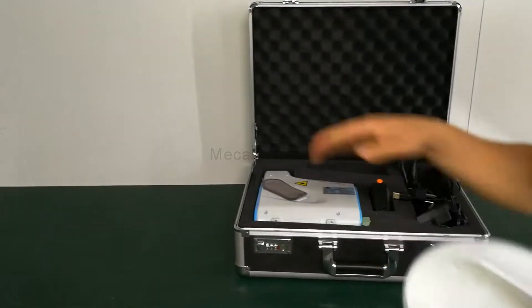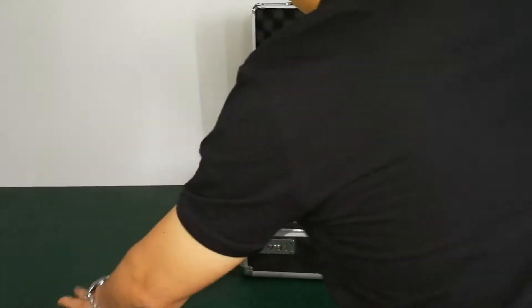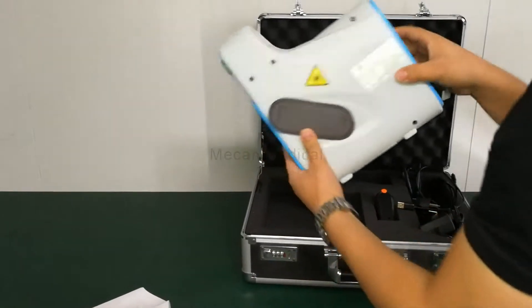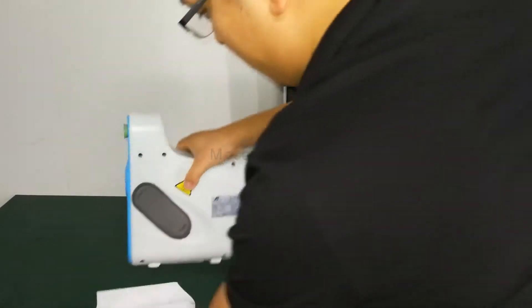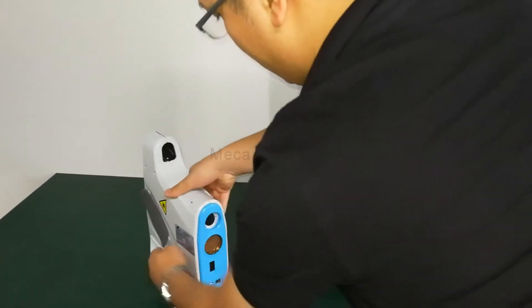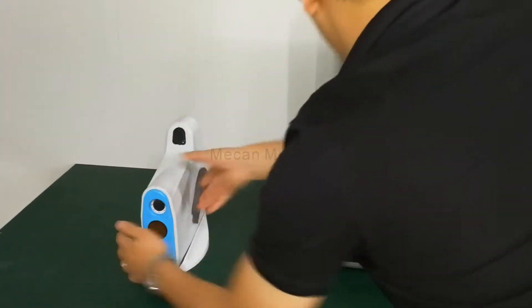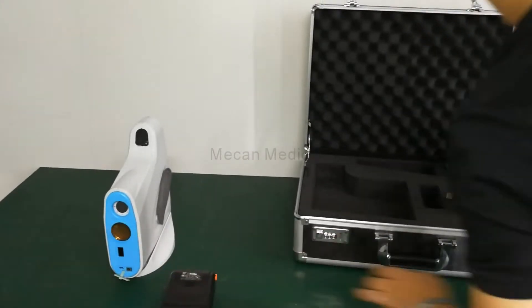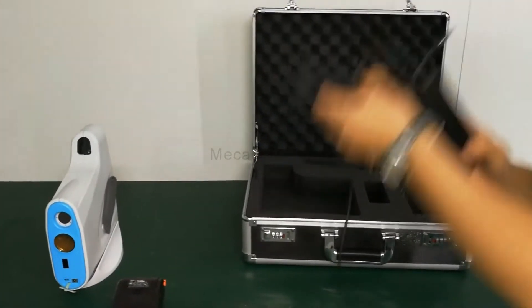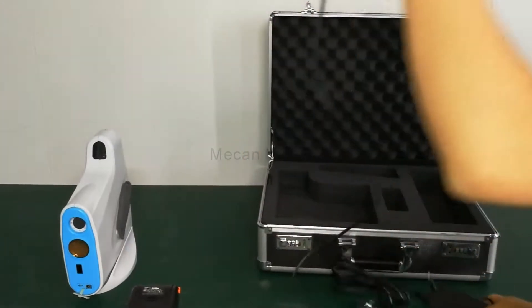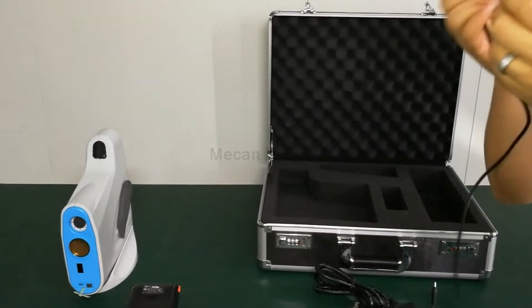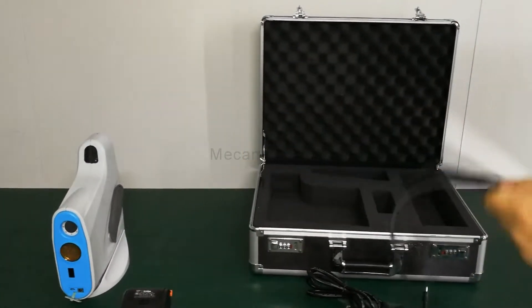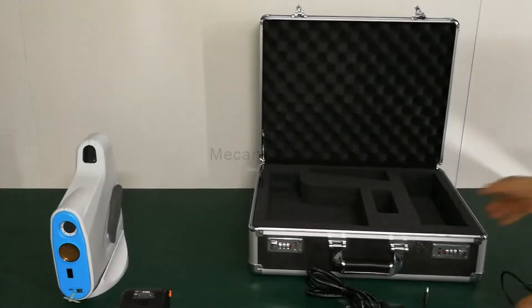Now I will show you this machine. That is the hood, that is the main machine, like this, and that is the printer. That is the power cable, that is the data cable to transfer the data to the computer, and that is the case.